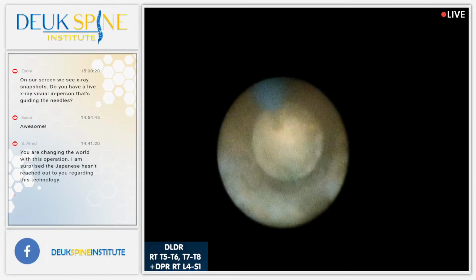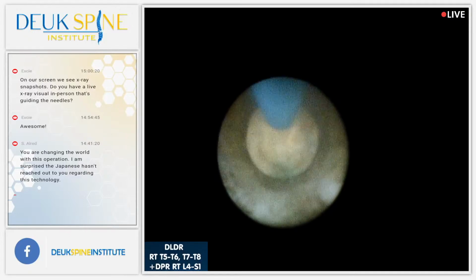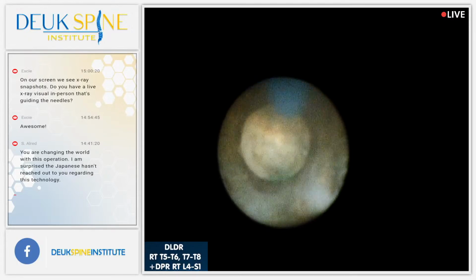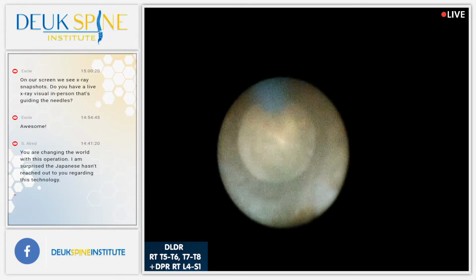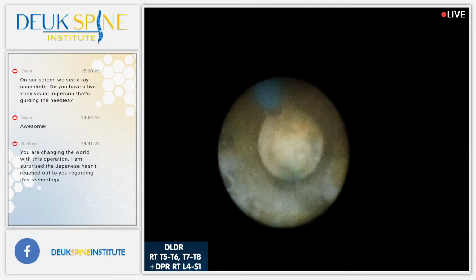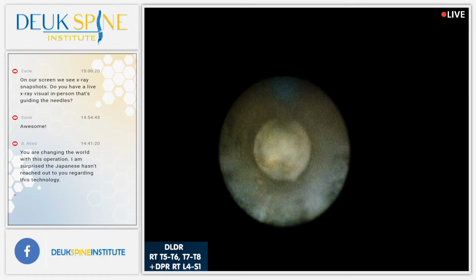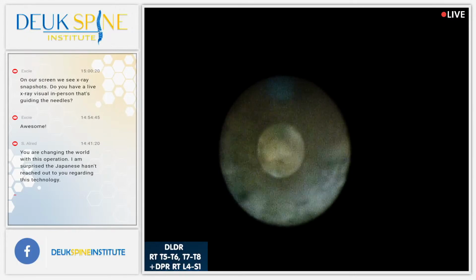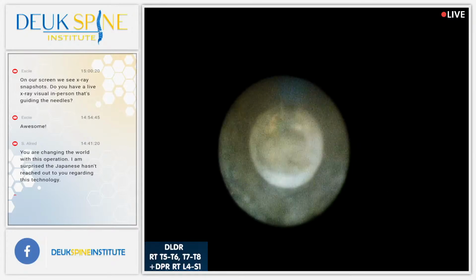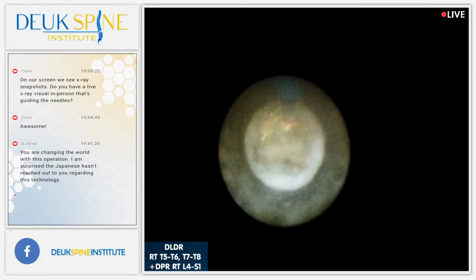That's calcium. Why would you have little calcium in there? If you look at that on an x-ray, you won't see it. But over time, it gets more and more, and you can see what's called a disc osteophyte, because so much calcium builds up that it looks like an osteophyte or a bone spur. Like I said, most of the time the bone spurs aren't the problem. It's the inflammation happening in this tear that is the problem. So you can see I'm cleaning that tear with the laser, and it's going very well.